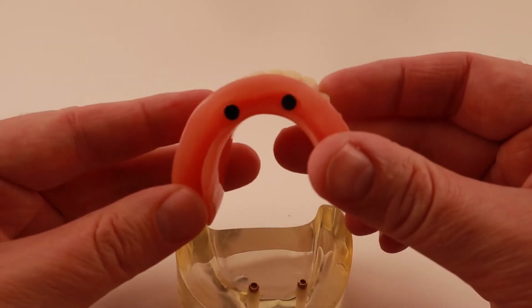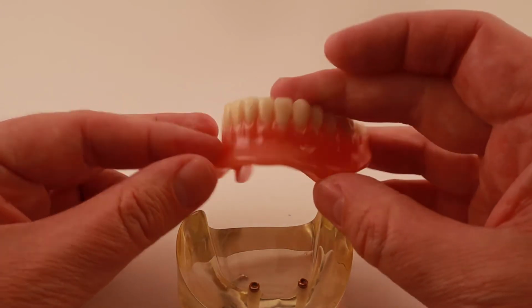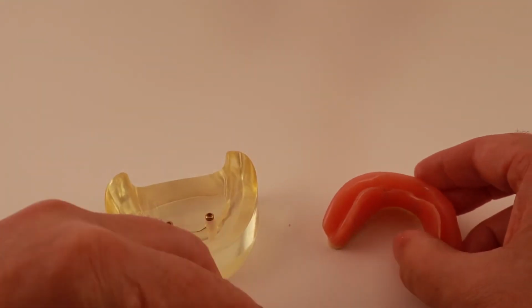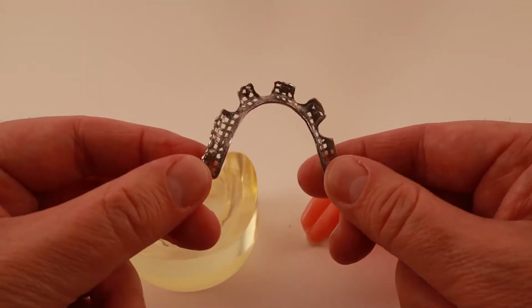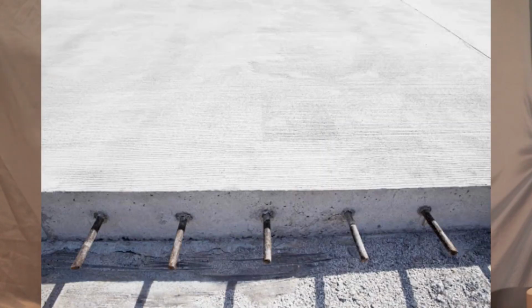The overdenture is hollowed out in the areas where the snaps will go. This weakens the overdenture. The metal framework reinforces the plastic around the hollowed out area and helps prevent it breaking. Reason number two is now because your denture doesn't move around, you are able to bite harder and chew better. The increased chewing force may crack the plastic of the overdenture. The metal framework strengthens it and helps prevent it from cracking, similar to how steel rebar is used to make concrete stronger.